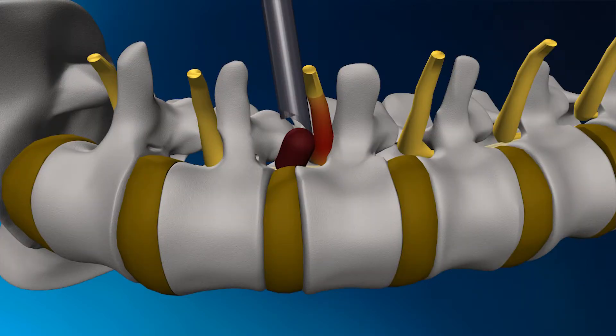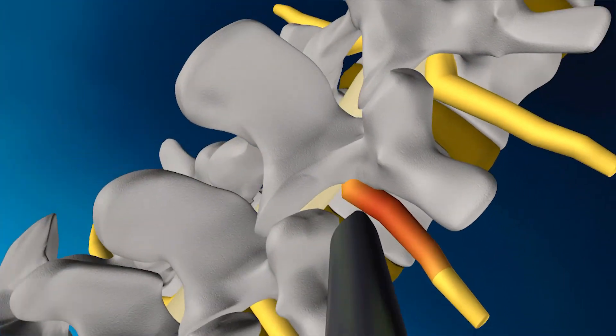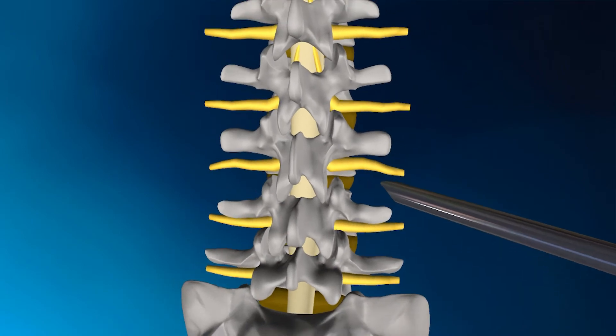The endoscope is inserted into the cannula until it reaches the herniation, then a small gentle instrument is passed towards the herniation to assist in the herniation removal.